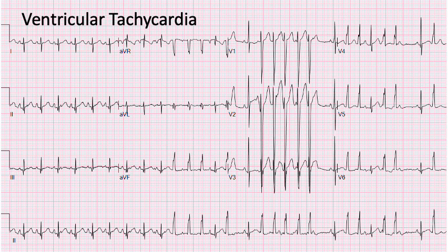Sustained ventricular tachycardia in the newborn period is not that common. What you will sometimes see is salvos, short salvos of ventricular tachycardia. So what you see here are wider complex beats that you don't see any relationship between V's and A's. Here's an A, here's an A, here's an A, but there's 5 V's here. And they often come in short salvos. So this is a pretty classic finding. If you're going to see ventricular tachycardia in the newborn period, this is what you tend to see, these short, quick salvos of monomorphic, non-sustained ventricular arrhythmia.